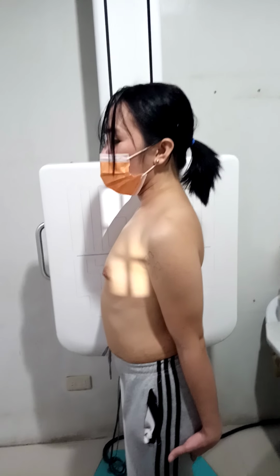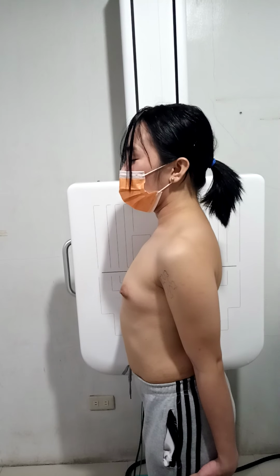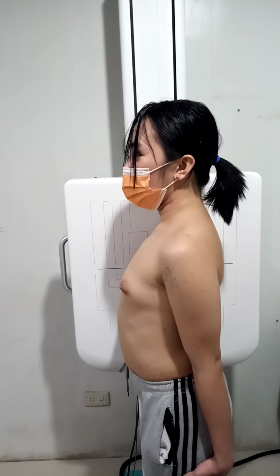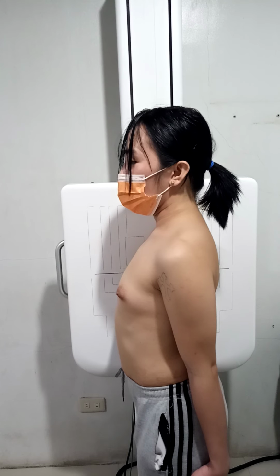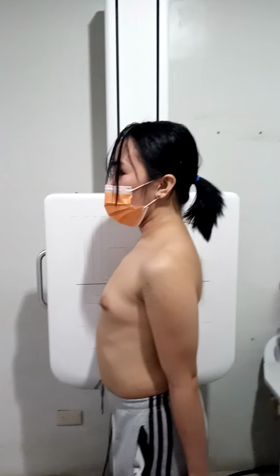In the evaluation criteria for the lateral sternum, the anatomy of interest should be seen on the radiograph. The entire sternum must be clearly visible. Then, in position, there should be no rotation of the sternum, and the sternum must be visualized with no superimposition of the ribs, with the shoulders and arms drawn back. So there should be no superimposition with those. In exposure, no motion, sharp bony margins, and optimal contrast and density to visualize the sternum should be demonstrated.